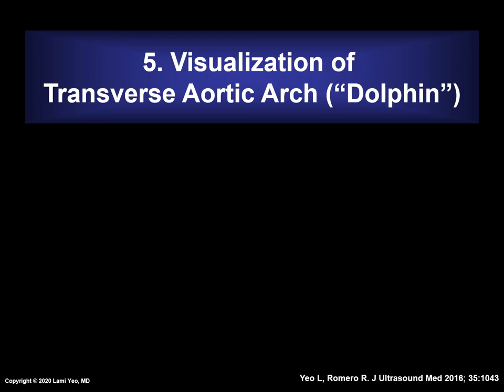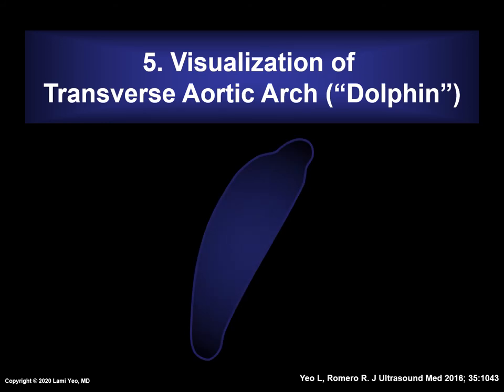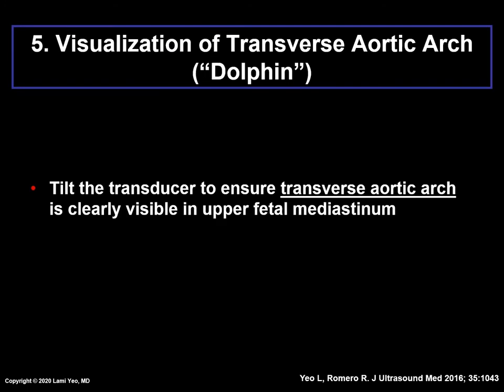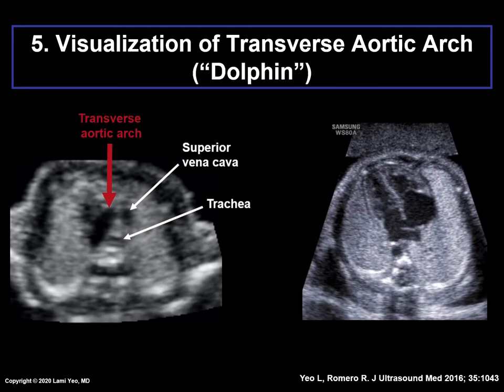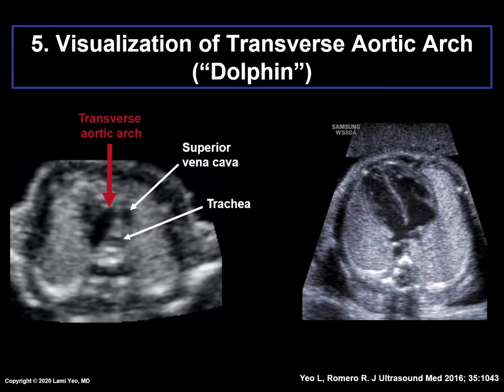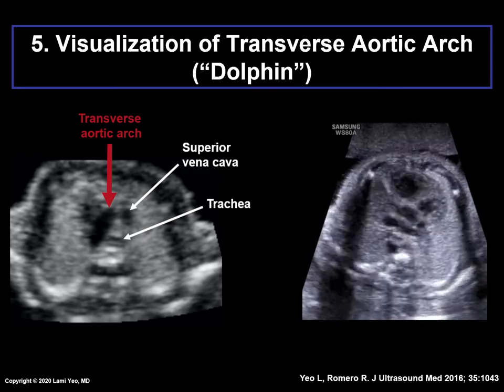Another recommendation when performing the FINE method is to visualize the transverse aortic arch, or what we call the dolphin. After an appropriate apical four-chamber view has been obtained, the transducer should be tilted slightly to ensure that the transverse aortic arch — or dolphin — is clearly visible in the upper fetal mediastinum. Confirming visibility maximizes the chances that it will be discernible within the STIC volume analyzed by FINE. The transverse aortic arch looks like the back of a dolphin, along with the cross-section of the superior vena cava and trachea.